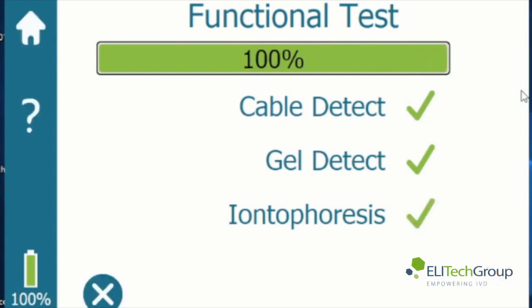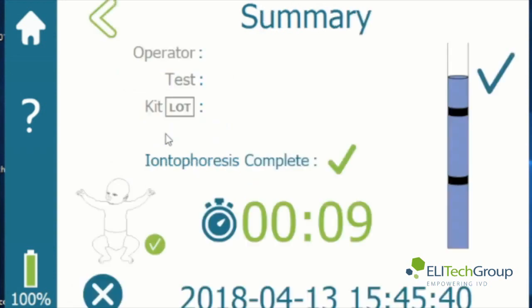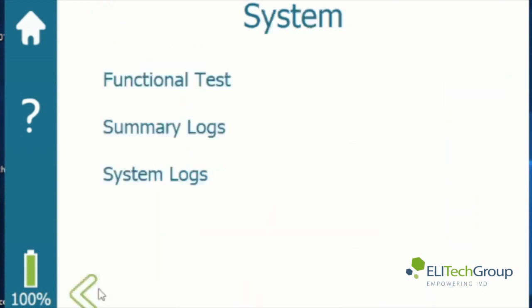The test is 100% — everything is working as it should. Now you can exit out of this page and go to the summary logs. This shows you tests that have been run, whether there was enough sweat, the operator, the test, the kit lot number, whatever information is entered, the date, the time.